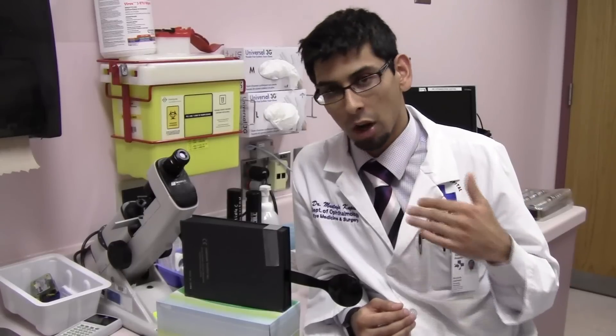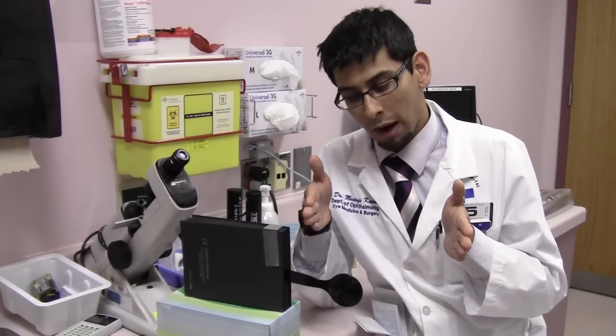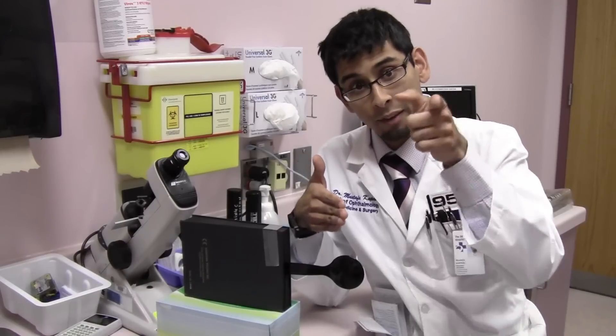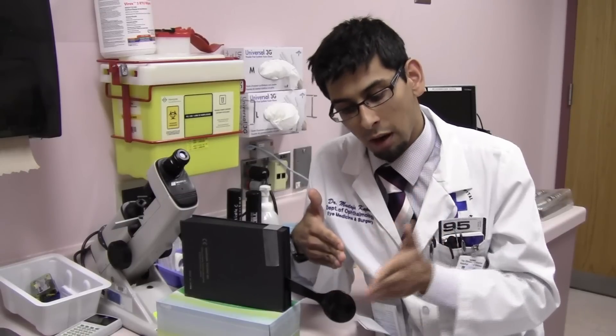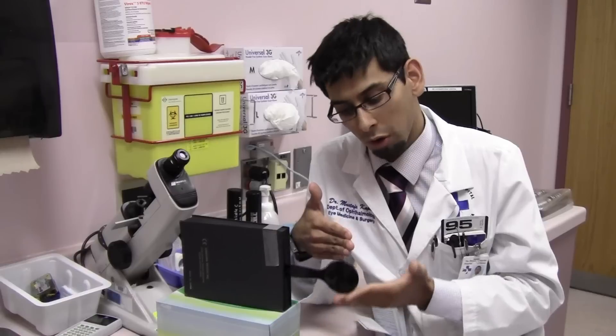This test is used for finding tropias — manifest deviations in alignment of gaze. That means this deviation is going to be present all the time; it's not intermittent in nature. Let's take a look with deviation. These are my eyes — this eye is turned inwards. Now we're going to bring the cover up. This eye is fixating on the target. Bring the cover up — the eyes don't move. Take the cover away — the eyes still don't move.